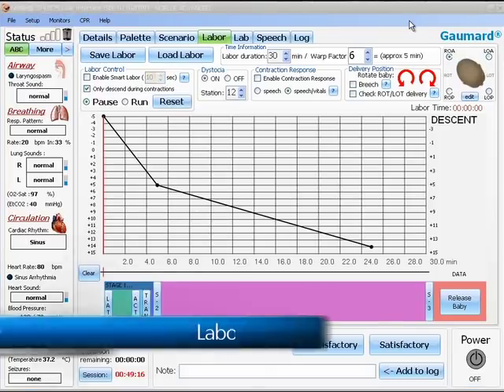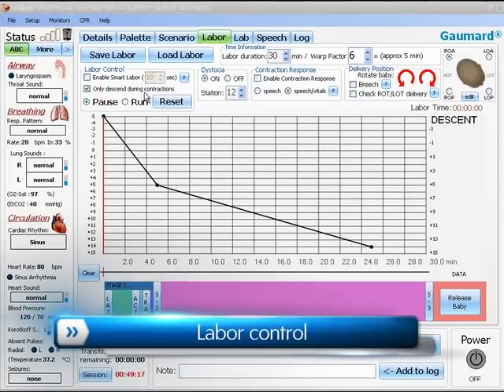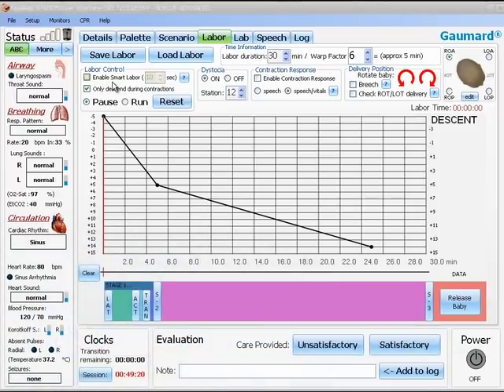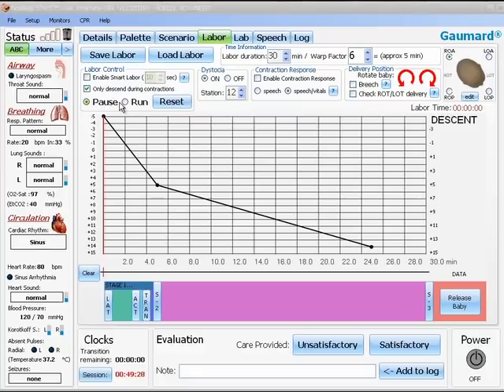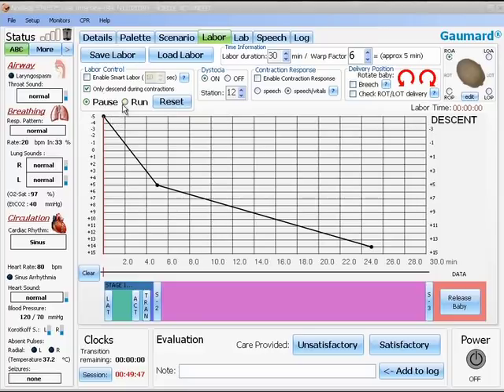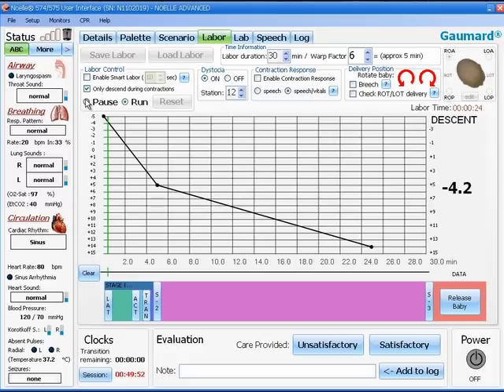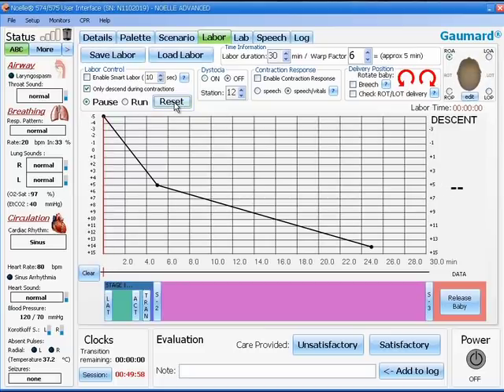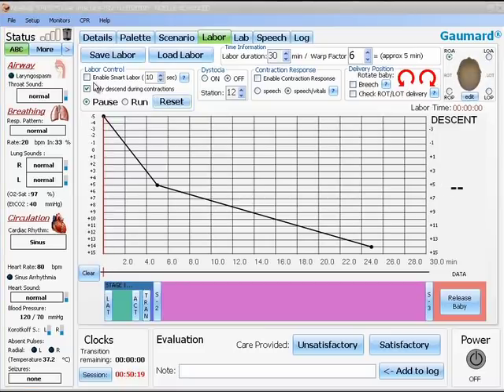The next box down is called labor control. Labor control has four functions in it. The obvious ones are pause, run and reset. This is where you control the actual movement of the motor. Run begins the motor moving. Pause stops the motor moving wherever it is along the scenario path. And reset sends the motor back to the beginning position.